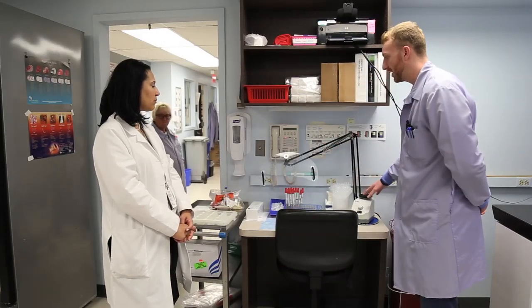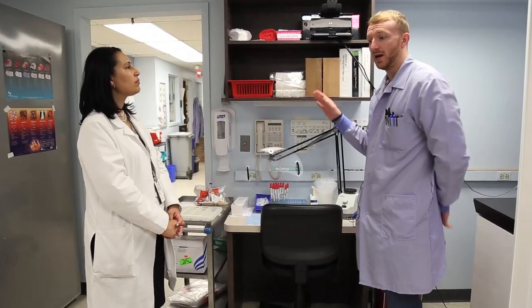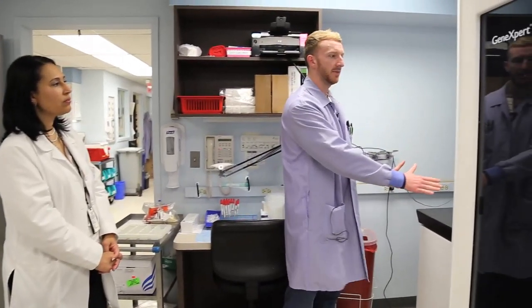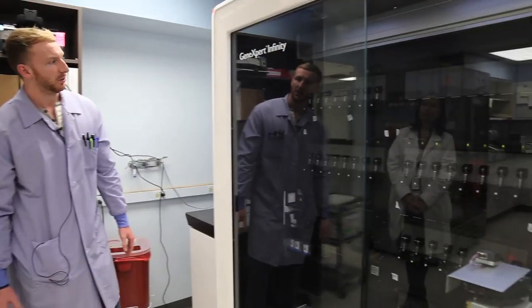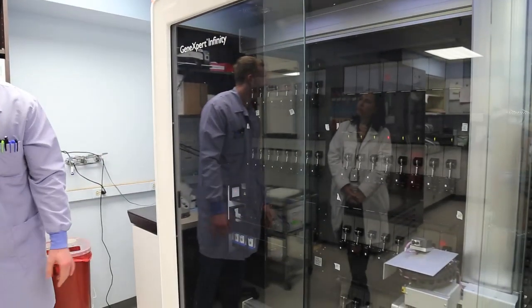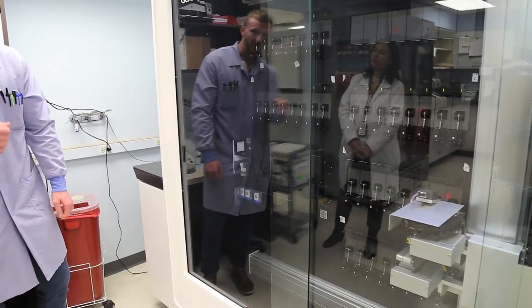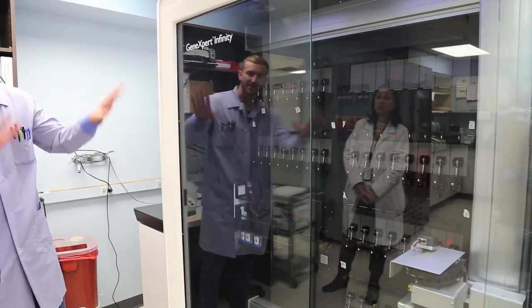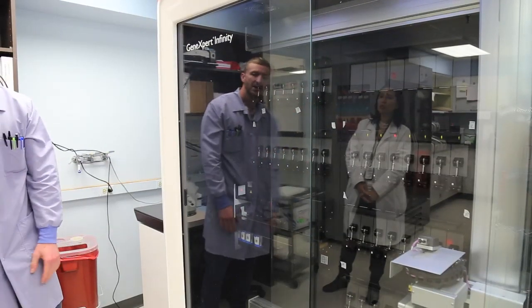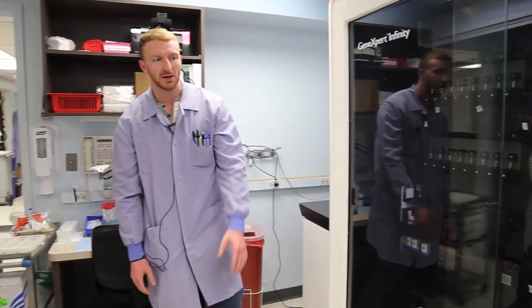The swab gets vortexed with a buffer and loaded onto a cartridge. Minimal hands-on time, less than 5 minutes. Then the cartridge comes over here and is loaded onto this enormous machine with maybe 60 different doors that can be simultaneously running, and it's random access. Like I said, it results in about 1 hour.